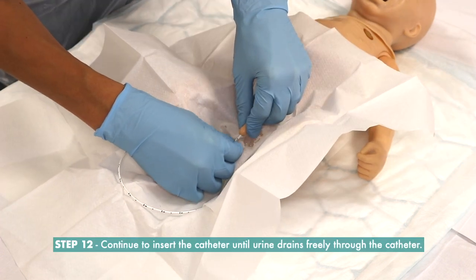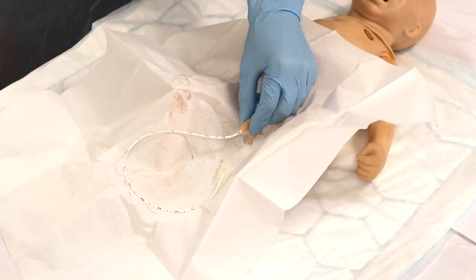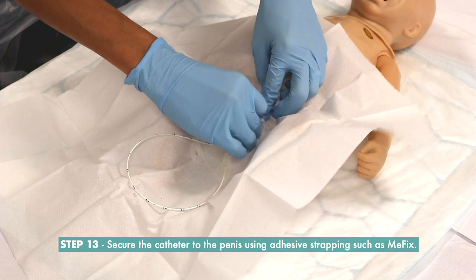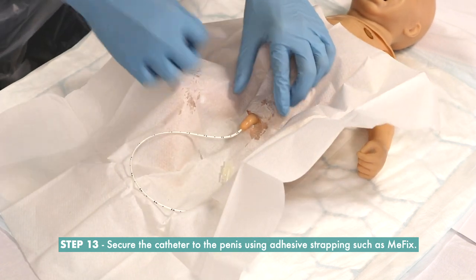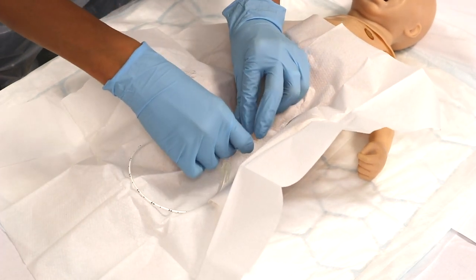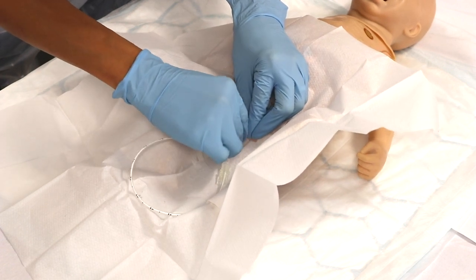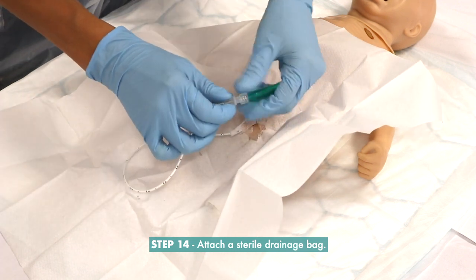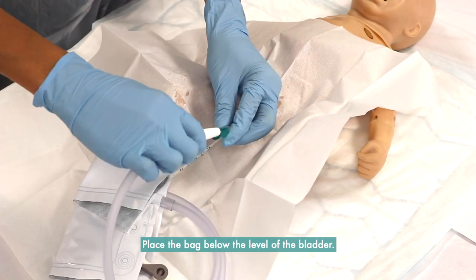Step 12: Continue to insert the catheter until urine drains freely. Step 13: Secure the catheter to the penis using adhesive strapping such as MeFix. Do not tape to the neonate's leg. Step 14: Attach a sterile drainage bag and place the bag below the level of the bladder.